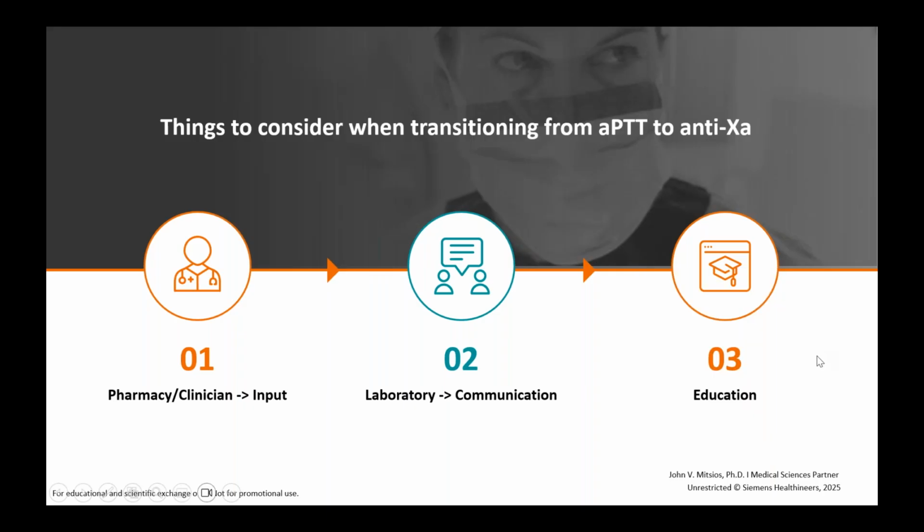Proper laboratory communication. How do we get that information, properly conveying that? And of course, that third bucket is really education. Fostering the education, talking about the clinical utility, showing the importance of these decisions that can be made, these different laboratory assays that are available, informing our clinical staff: these are the different assays, these are what these assays are intended to do, this is what they're measuring, this is what they're monitoring, and so on.